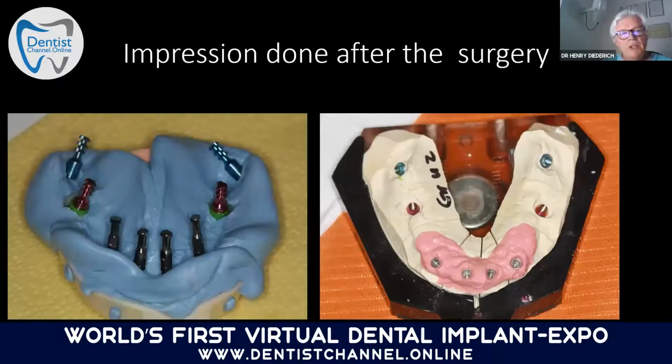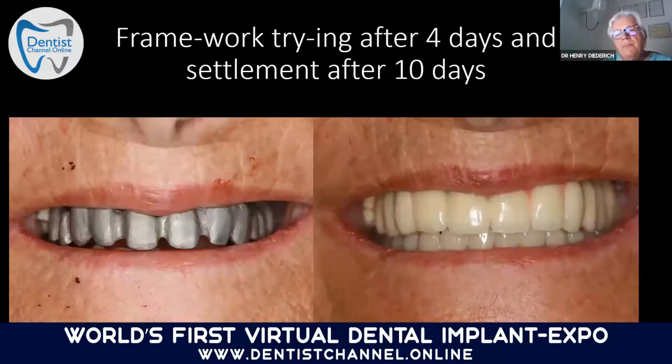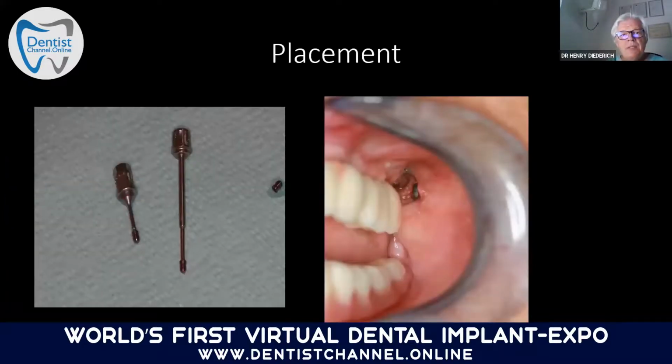We took the impression and the model. We did a try-in with the frame, and then here, 10 days later, we could already settle the metal ceramic bridge. See the placement. Also look at the pterygoid implant another time.